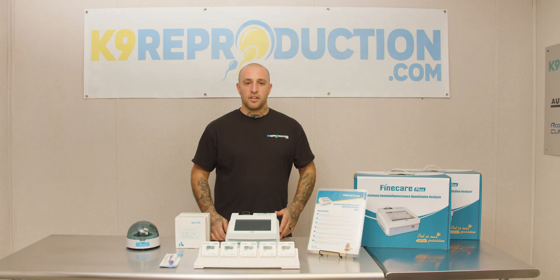Hey guys, this is Travis with K9Reproduction.com. We're here today talking about the WANFO Progesterone Analyzer.